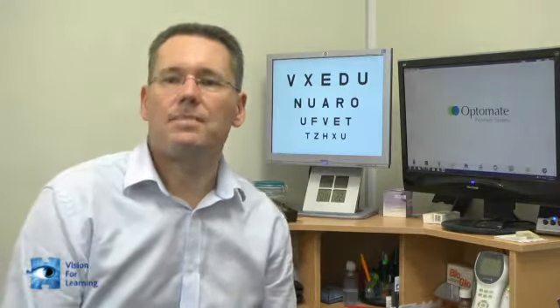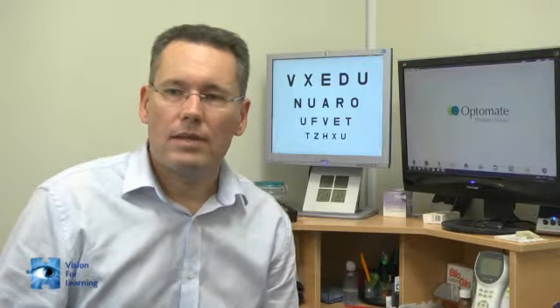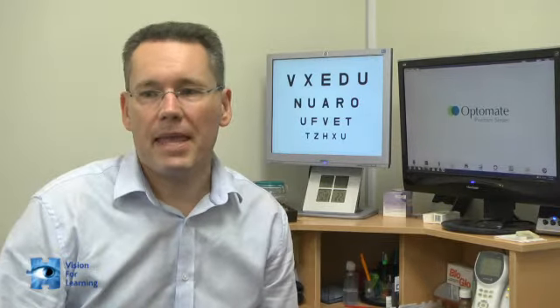A few other points that I'd like to make about tinted lenses. Firstly, if a student responds positively to tinted lenses, this does not mean that they have dyslexia. The test that we're using here is only a test for visual stress, and the test for dyslexia is a diagnosis which is made by an educational psychologist or an educational specialist.